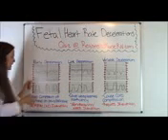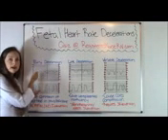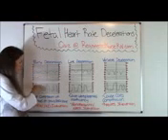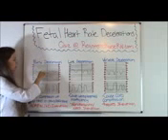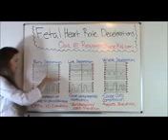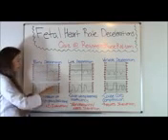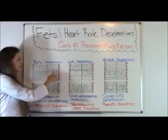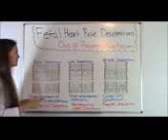The key is that mom's contractions are mirroring the baby's dip in heart rate. So you have contraction, contraction, then you have heart rate goes down, goes back to baseline, goes back down again when mom has a contraction. It goes back up whenever mom's not having a contraction, back to baseline, and then it dips again whenever mom has a contraction. Okay, that's early deceleration.